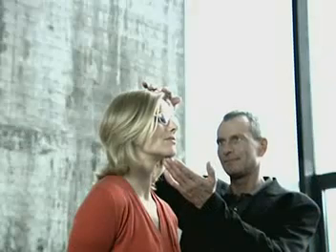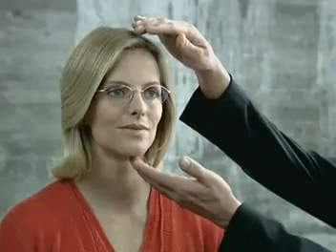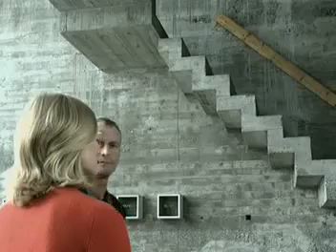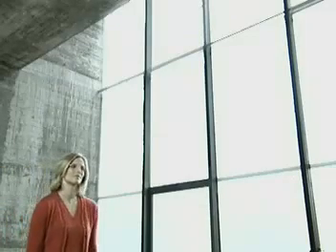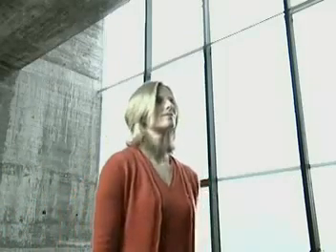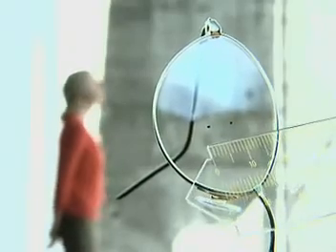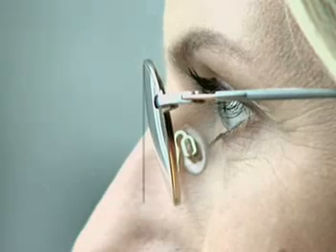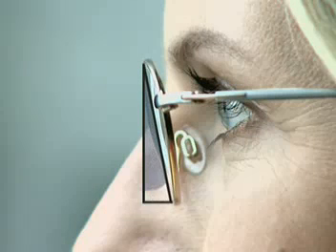You can naturally determine the pantoscopic tilt of the pre-fitted frame with the method of your choice. We would like to show you a simple method to determine the pantoscopic tilt not in degrees but in millimeters. First, mark the point of vision on the lens with the eyes looking straight ahead and the frame plane in the perpendicular position, as when fitting aspheric SV lenses. Ask the patient to move around a little in order to relax their body posture again. Now mark the vision point in the lens with the eyes looking straight ahead in this natural body posture. This also marks the glazing height. Measure the distance between these 2 points and note the value in millimeters. Rodenstock will use this value to calculate the angle of pantoscopic tilt for you.